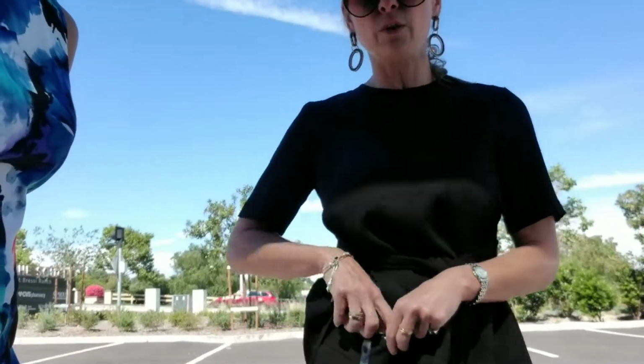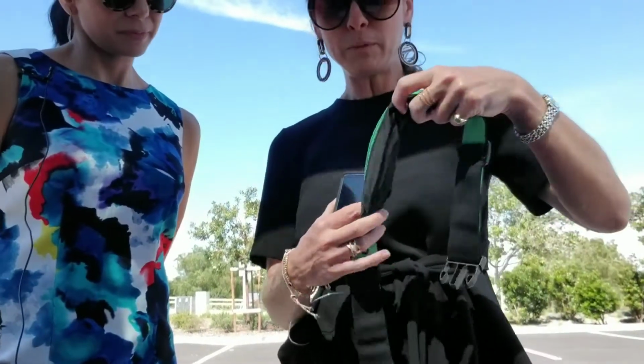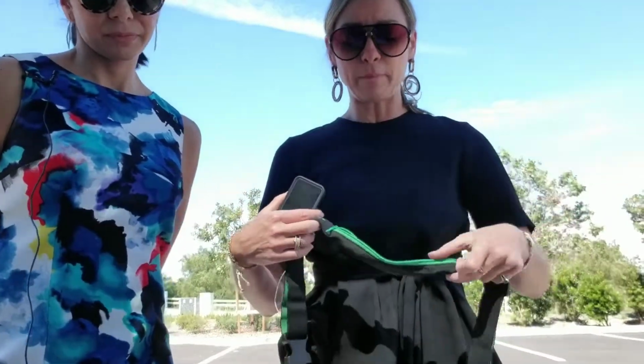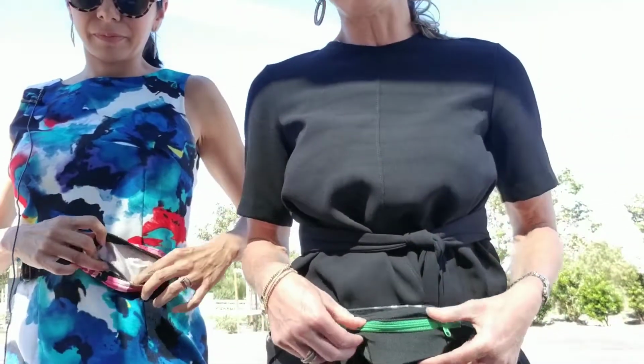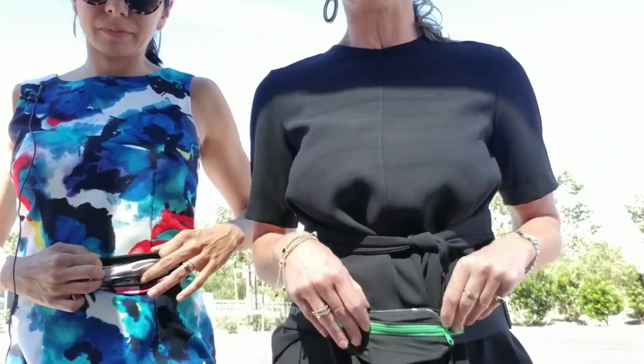There are other ways to wear it, such as if I'm going to be active. One of the big advantages of the tubed pump is that I can also wear it in a pouch, and I choose to do this when I run. I have run multiple marathons or half marathons, and what I do is put it in a band that goes around my waist, and it keeps it nice with all my extra goo packs that I might need to help out with my blood sugar while I'm running or being active.